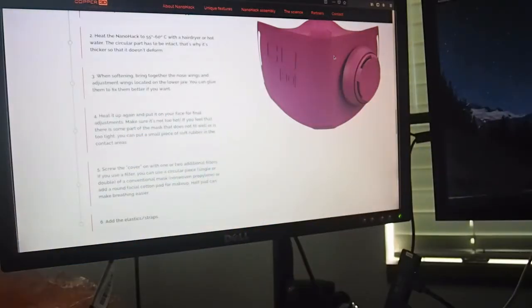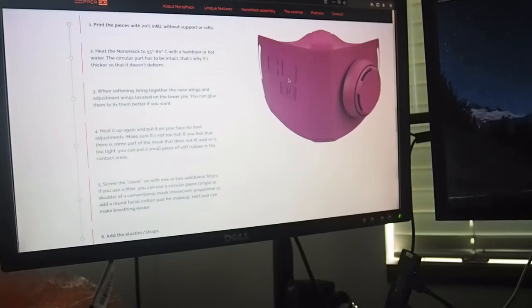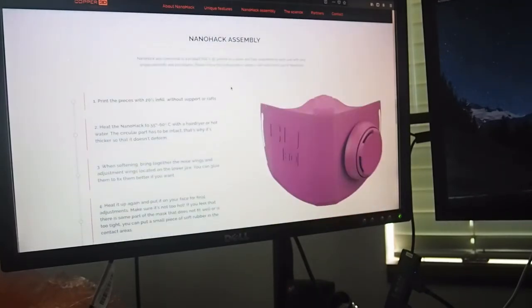So then you screw that all together. You add your last little bit of elastic straps. I may not have any elastic around, so I might just use string over around the ears. And then you go from there. So then you have a mask, and hopefully we can print one of these every 3 to 5 hours on my particular printer. I might start degrading the print quality to see if I can go faster. So anyway, let's get to it.